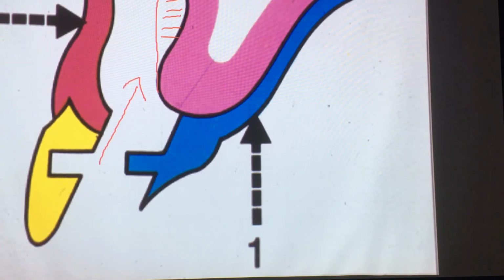So it's not just undercut for the clasp and the guide plates. It's undercut for the tissue flanges as well. If you leave that big space under the flange, the patient will definitely not tolerate that, full of lunch and breakfast and dinner and who knows what else. So most likely the practitioner will chop the flange off there and shorten it, but that might not look good aesthetically if they've got a whole smile line. All could have been changed with a different path of insertion.